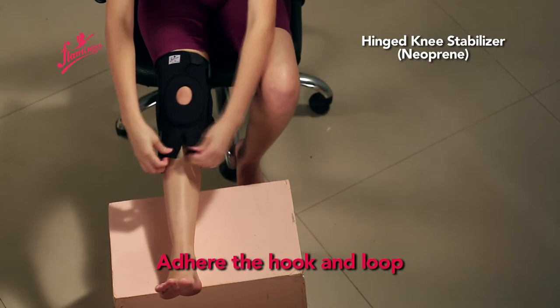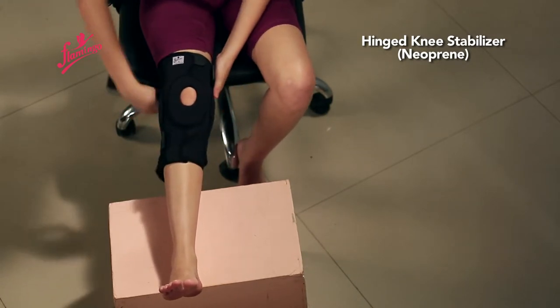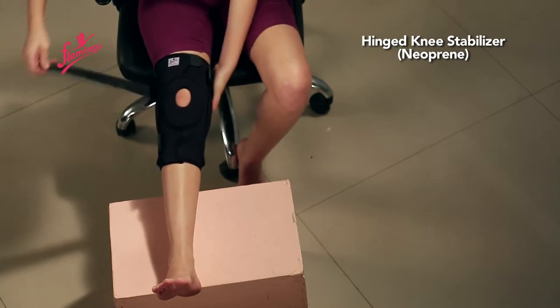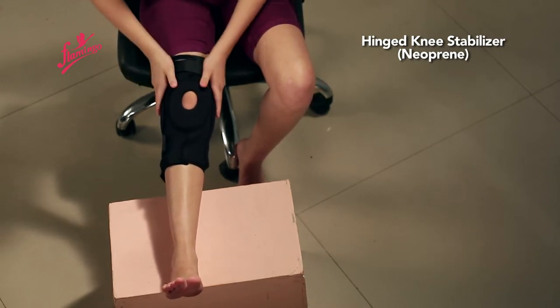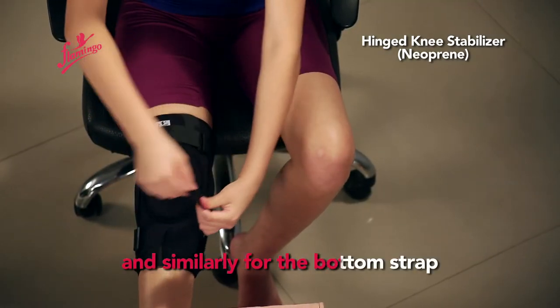Adhere the hook and loop to a comfortable compression. Tighten the hook and loop on the top strap, and similarly for the bottom strap.